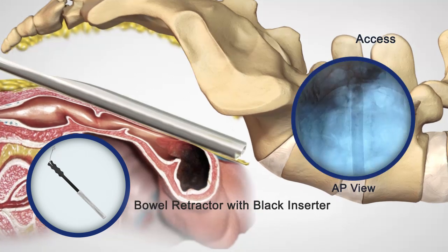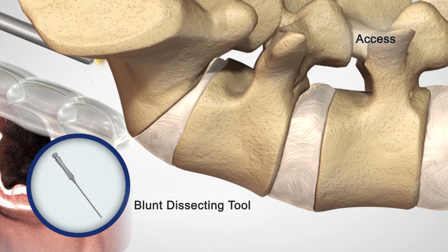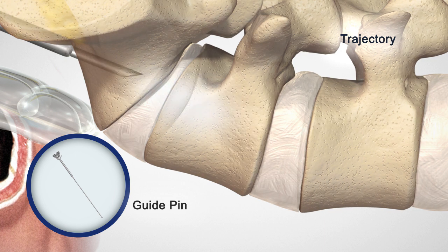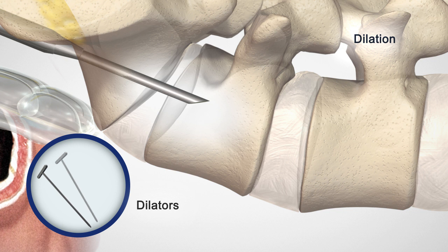Inflate with a mixture of saline and contrast. Next, insert the dissecting tool over the bowel retractor and advance it along the midline of the anterior sacral surface with fluoroscopic monitoring. At approximately the S1-S2 junction, engage the beveled guide pin and tap it into L5.